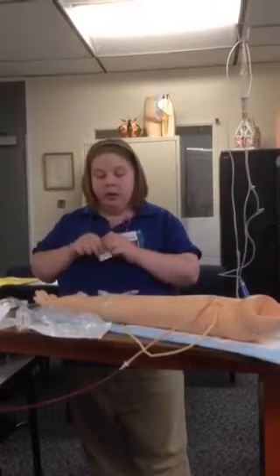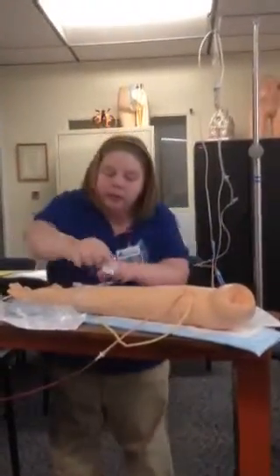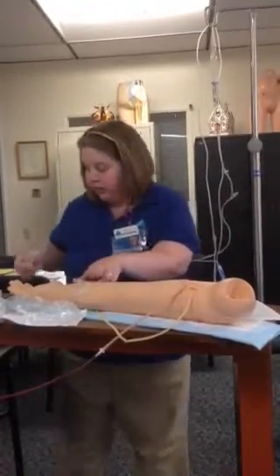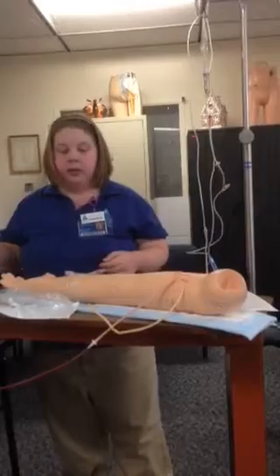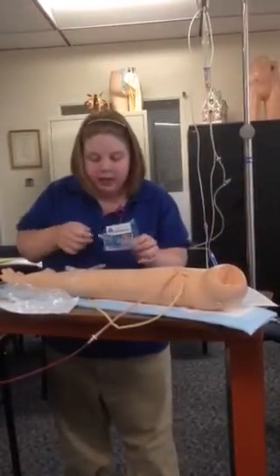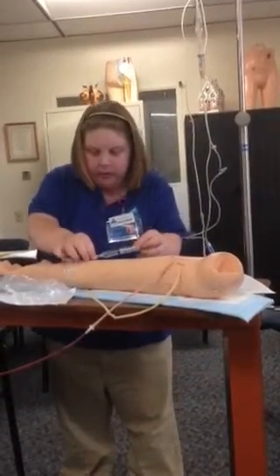I would have my gloves on. I'm cleaning their IV site, their tubing, and I'm attaching 6 milliliters of normal saline.